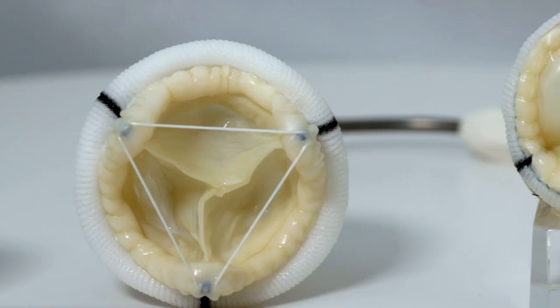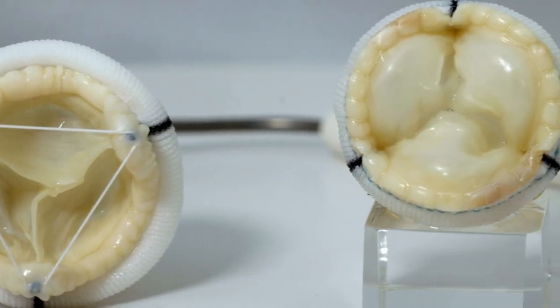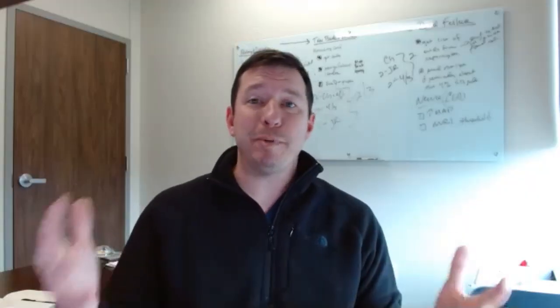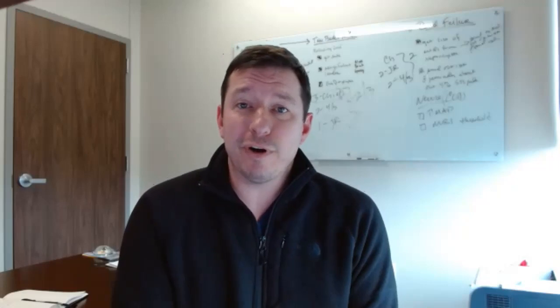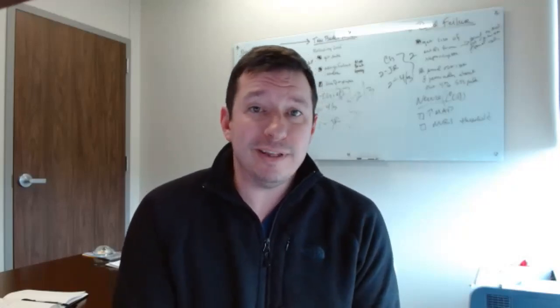The issue is sometimes a mitral valve repair, despite all of your best intentions, is not going as well as it should for the patient to provide a durable relief of their regurgitation. And so then you need to think about, hey, I need to put in a replacement here. Well, if that's the case, I don't want to stop a procedure, take the robot out, and change to a port access approach or a sternotomy approach. Well, really, the valves are pretty small. I can put it in through a little side port between the ribs and not really have to convert anything, maintain the same approach and the same limited chest wall trauma, and the patient can get over it just as well.